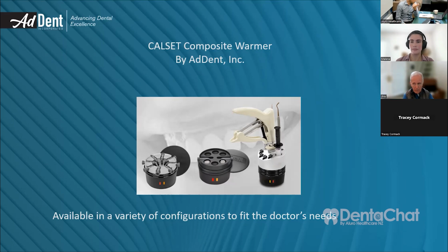So my first question is, if you have it on the green, amber, or red settings, it doesn't matter if it's local anesthetic or if it's a composite, or you need to have a local anesthetic on a lower setting. The Calset heater doesn't know which tray it's being placed on. But obviously, if you're going to heat local anesthesia, you want to do it at the lowest temperature, which is the green setting, which is body temperature. So that's the first thing. You wouldn't ever want to heat local anesthetic to the high temperature of 68 degrees, so that would be kind of obvious.